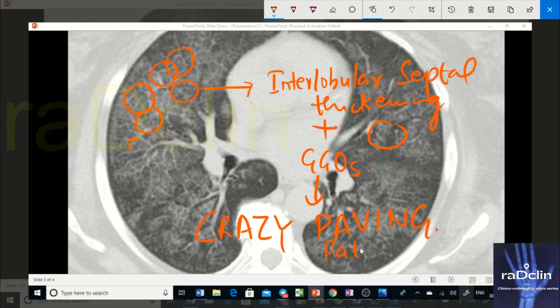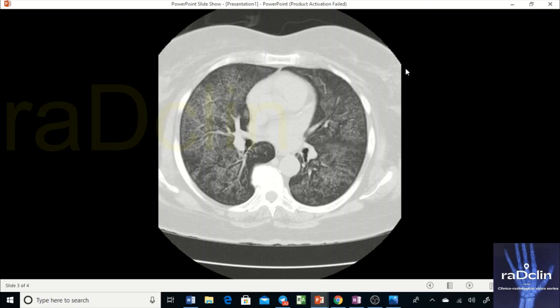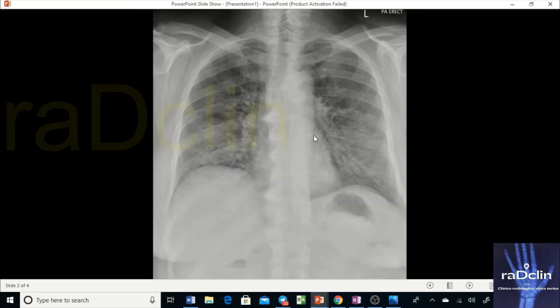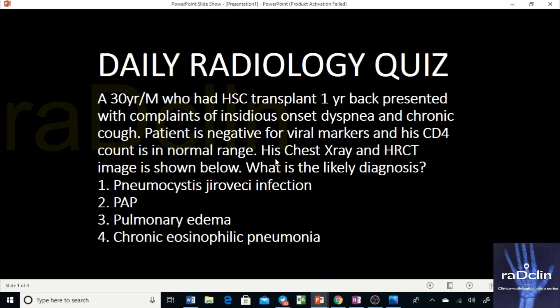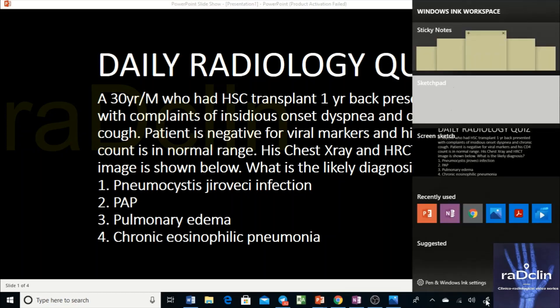On HRCT we see a crazy paving pattern. On X-ray we saw GGOs with increased density and some fine reticular changes, though they could not be simply seen because the haziness is quite high. The imaging findings are suggestive of a crazy paving pattern, involving primarily the lower lobes but with near-diffuse involvement. Now look at the question and try to link the findings with the history.